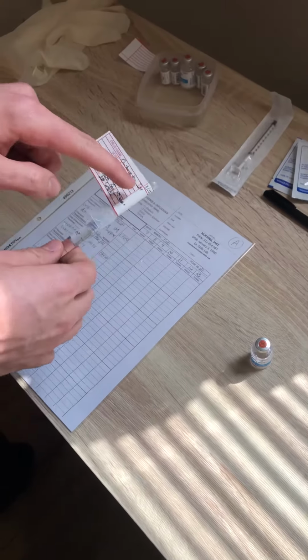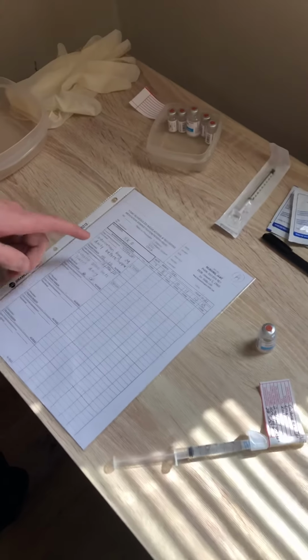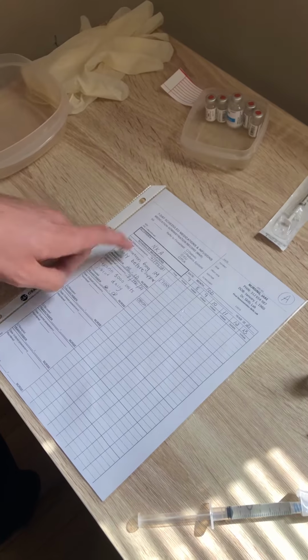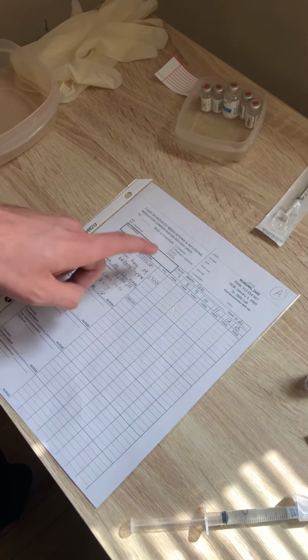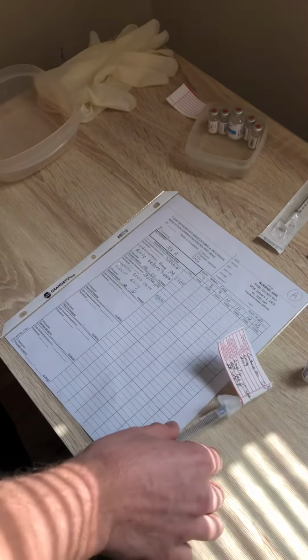Okay, and so right route is intramuscular. As I've checked my drug monograph, it doesn't state on here, but on my drug monograph, it can be given intramuscularly. And right time frequency is daily before supper, patient hasn't eaten, and it's for 1700 and it's 16:35, so it's safe to administer it.